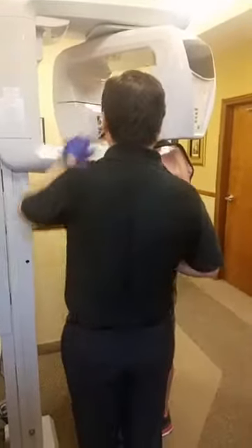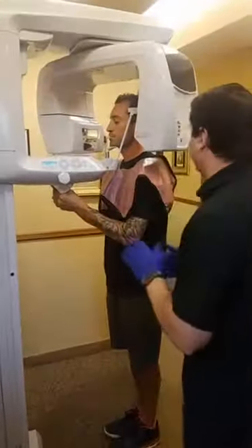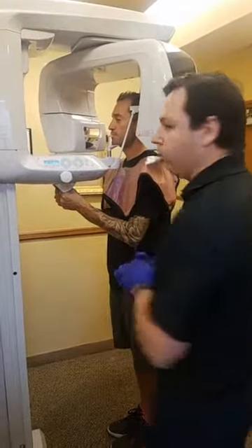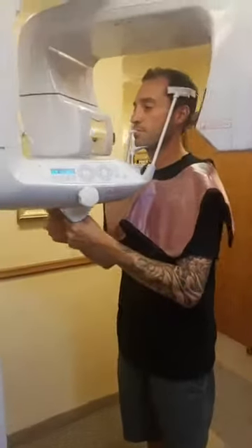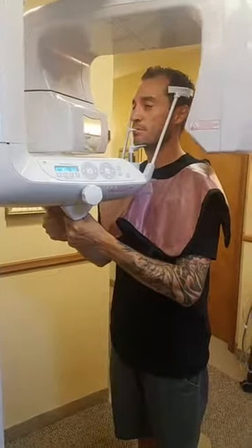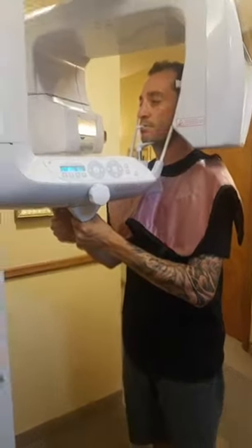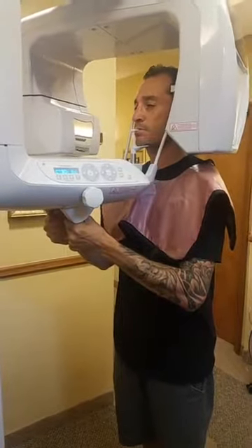So David, we're going to have you get into the machine here. We're going to set you up. I'm going to make sure that you're stable in that area. And then I'm going to have you swallow, put your tongue on the roof of your mouth, and hold still for me. And now the machine is going to go ahead and move around, sing a little song, and take a three-dimensional image of the specific area that we're going to work on today.